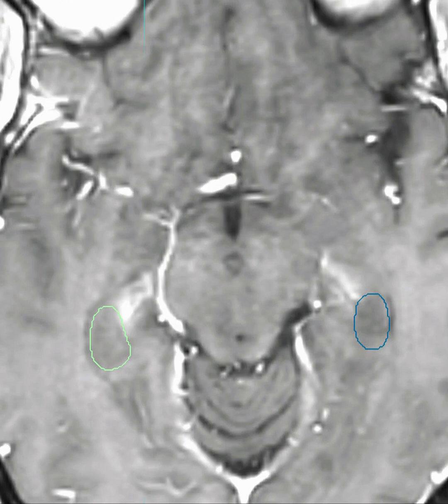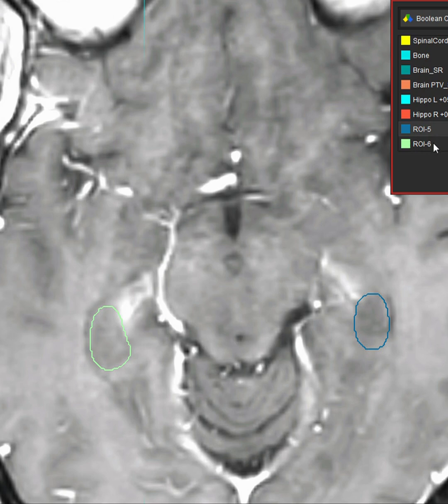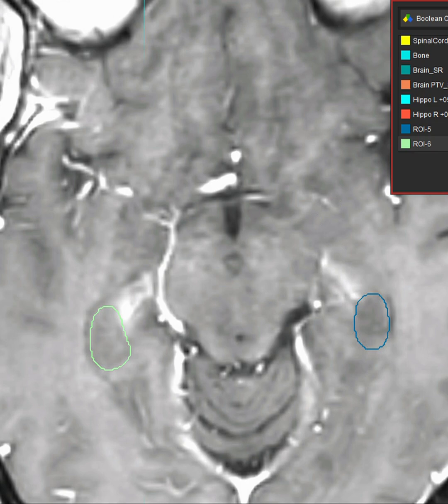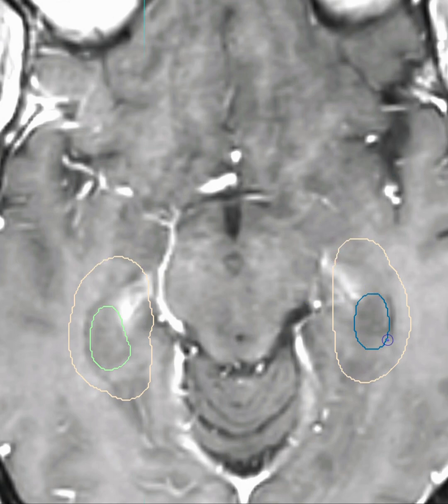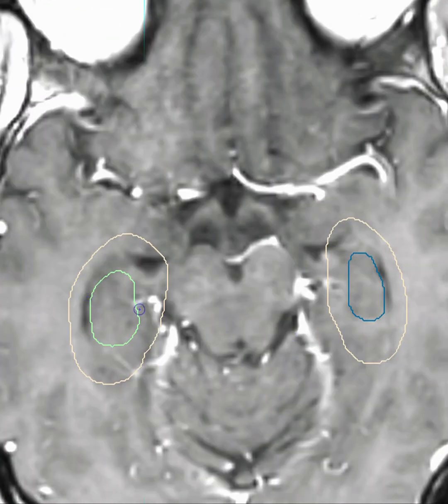The last step is to make a hippocampal avoidance structure. I'll do a Boolean operation where I take the two hippocampal structures I just made and add five millimeters, and call it a hippocampal avoidance. This is what I will subtract from my PTV when planning. I'll use the hippocampi themselves as an OAR, but I will subtract the hippocampal avoidance from the PTV.